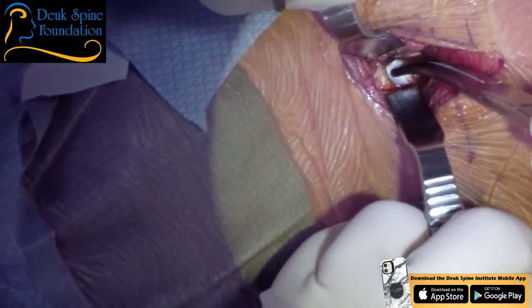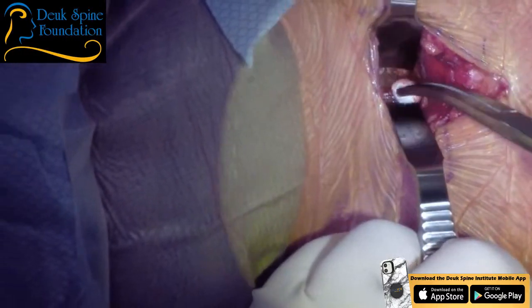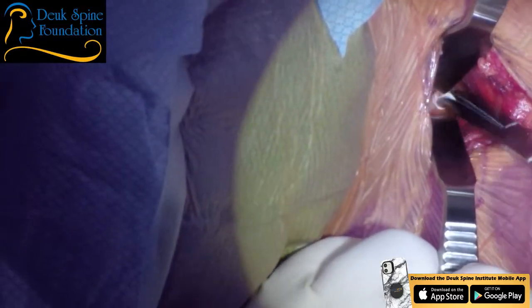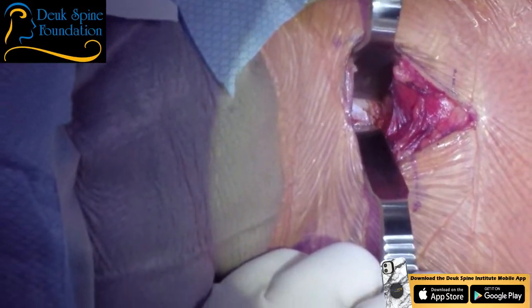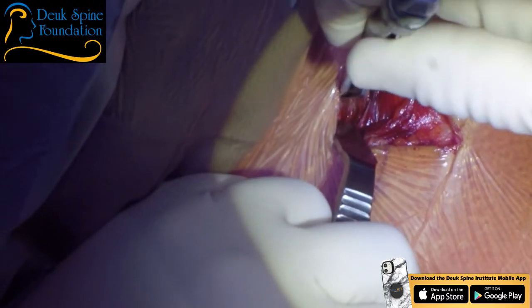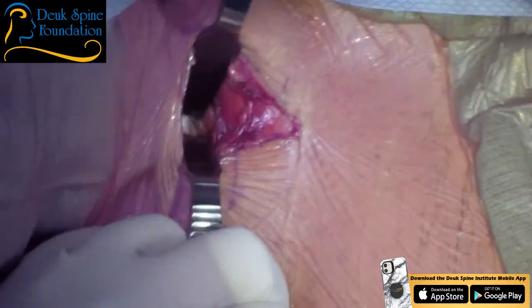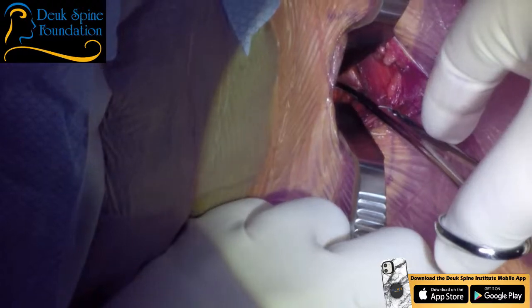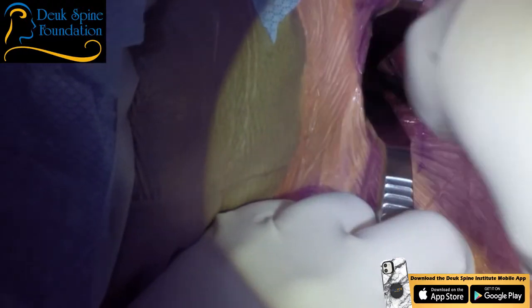I want to connect the dots, Dr. Patel. That's 4-5, right? And then this has got to be 5-6. And this has got to be 6-7 down here. But I want to make absolutely sure, as sure as humanly possible, bipolar. So 6-7 is the hardest disc to get to if you're not counting C7-T1. And C7-T1, scissor, almost never is a problem. Because it rarely herniates.